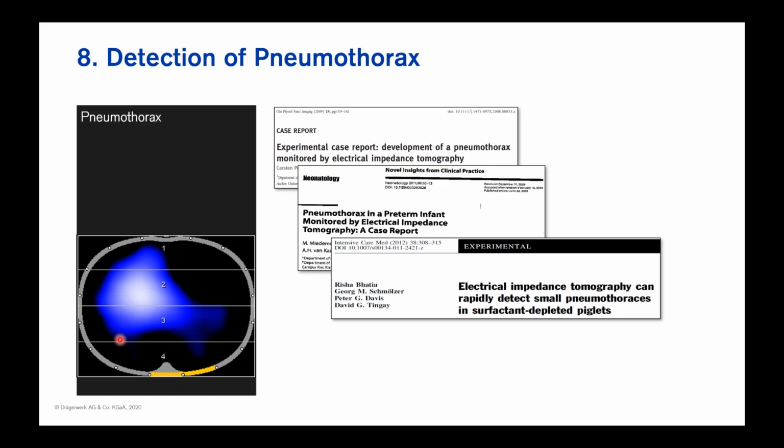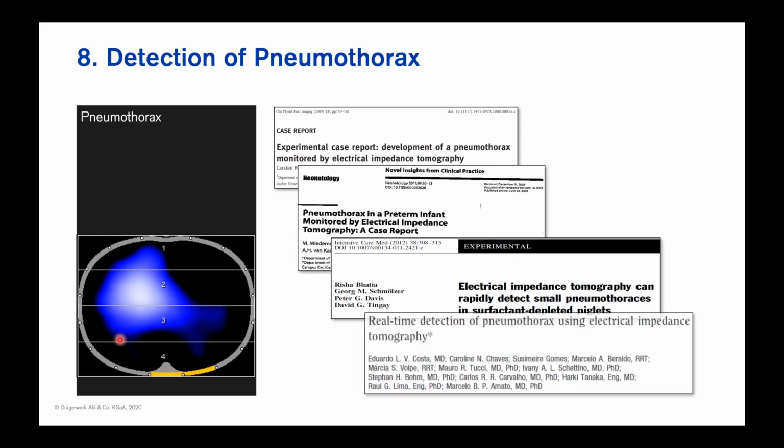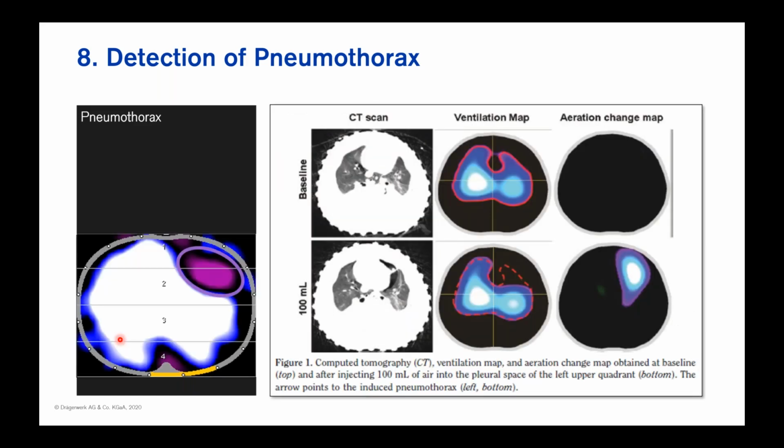That is clear. But then when we enhance the colors, you will also see the purple spots, the reconstruction artifacts, because in comparison to the lung tissue, of course, the area with the pneumothorax, which contains pure air, has a completely different impedance as compared to the lung tissue located next to this spot. So that is also a characteristic pattern that can alert of a pneumothorax.